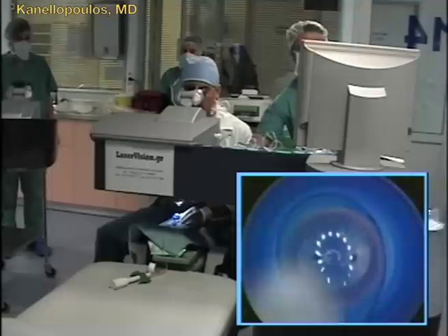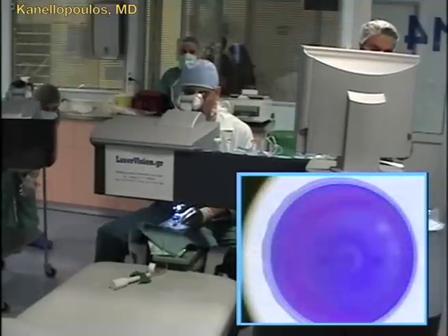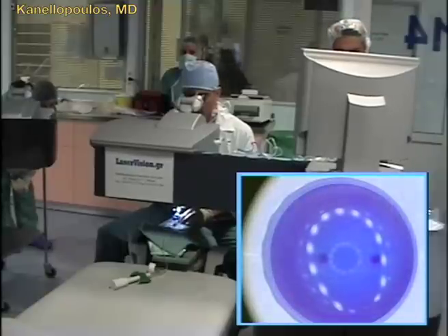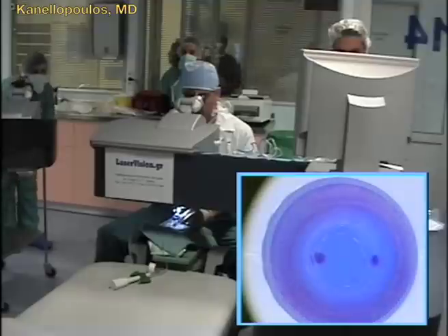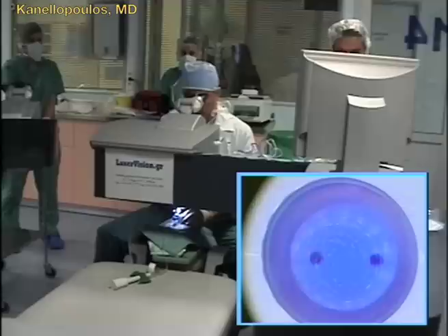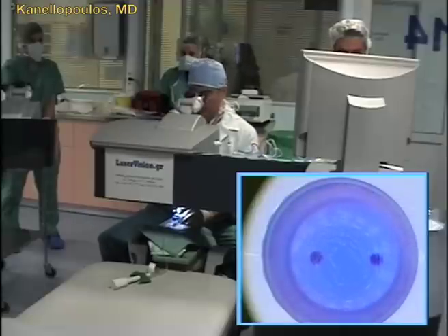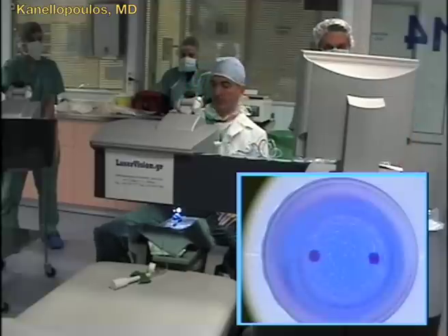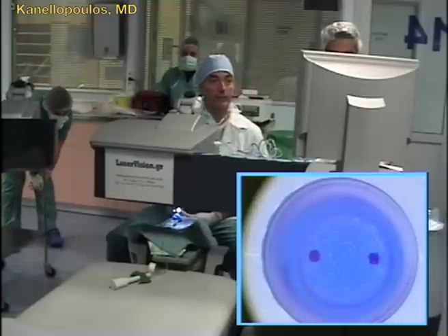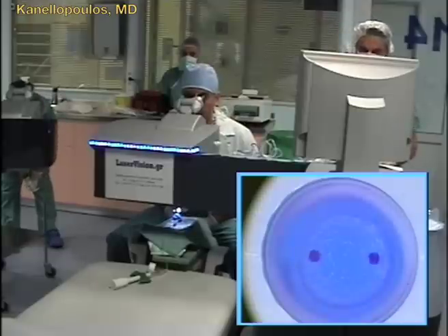We have pumped air into the artificial chamber to reproduce ocular rigidity up to about 40 millimeters of mercury. Here, the patient interface applanates the donor cornea, and we'll get a little bit more applanation in order to make sure that the amount of cornea we are going to trefine is well applanated. The surgeon turns to the screen and does the final calculations — where will the trefination be centered?